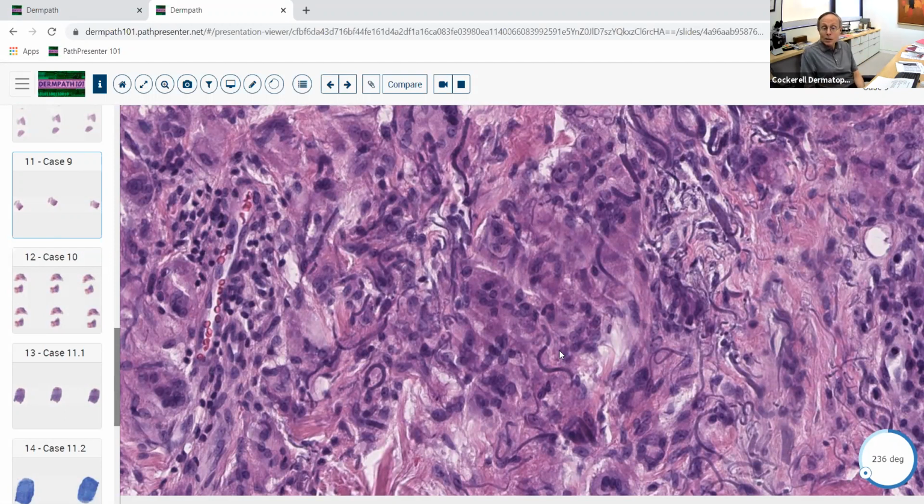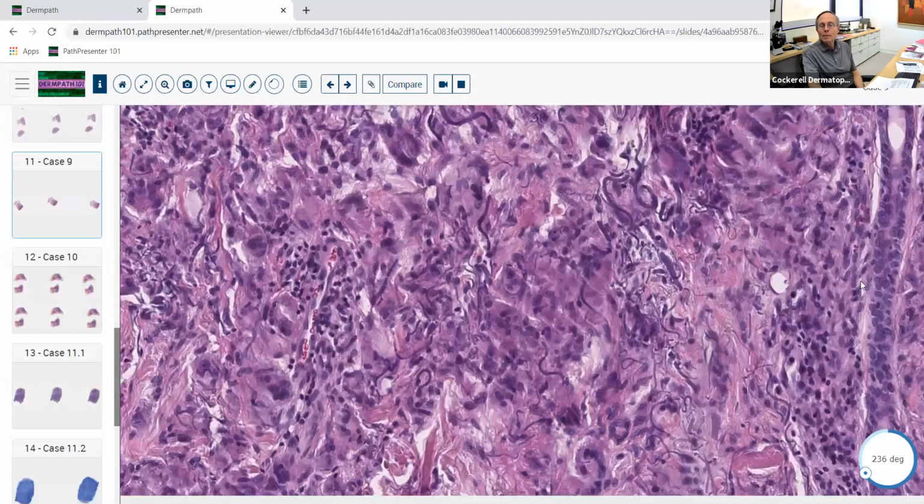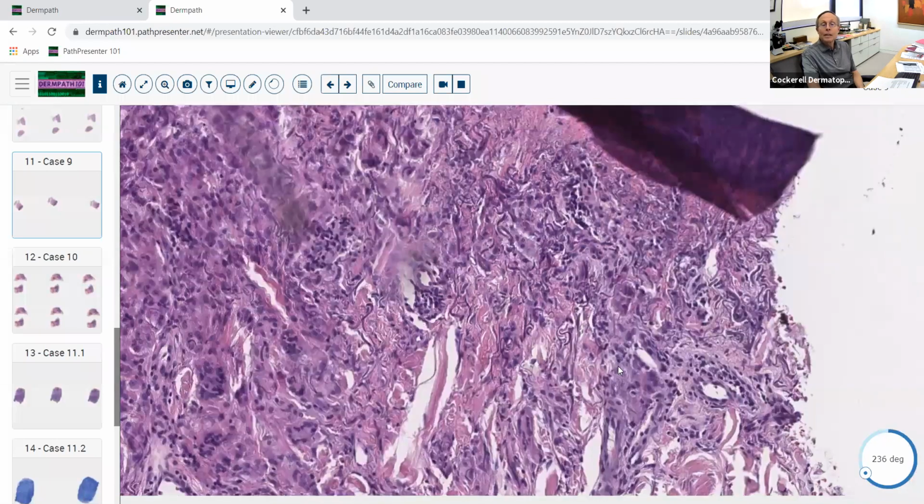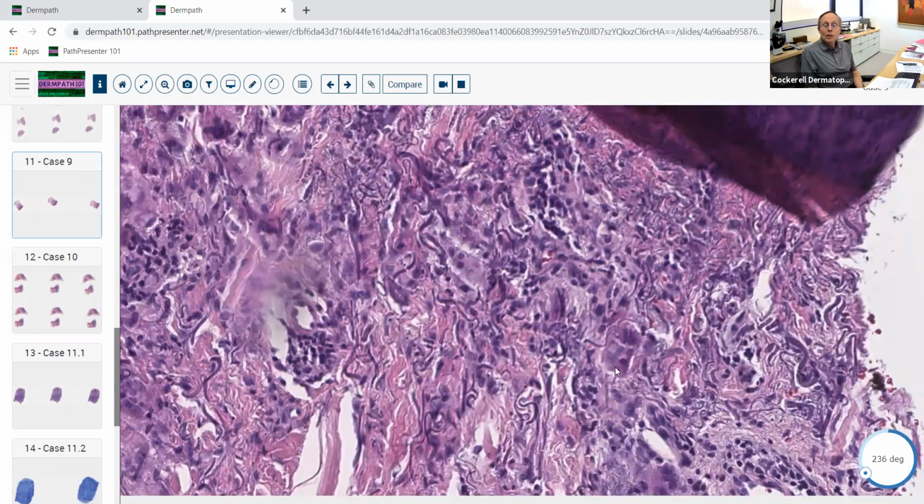They actually did an immunofluorescence on it. There was IgM that was coating the elastic fibers, and then these histiocytes were coming in and engulfing the elastic fibers, and then she's getting this horrible atrophic cutis laxa from the monoclonal gammopathy, which cutis laxa is associated with monoclonal gammopathy. And if it gives you that pattern, that's really what you see, because of the granulomatous inflammation that comes in secondarily to these opsonized elastic fibers. So this is what you see in actinic granuloma. If you're more of a lumper like I am, I tend to think of this as just a variant of GA on solar altered skin, but at least realize that there is a form of this granulomatous inflammation that comes up on severely sun damaged skin in some individuals.